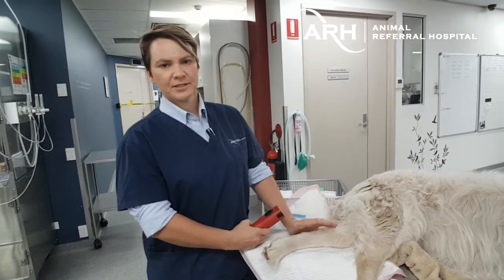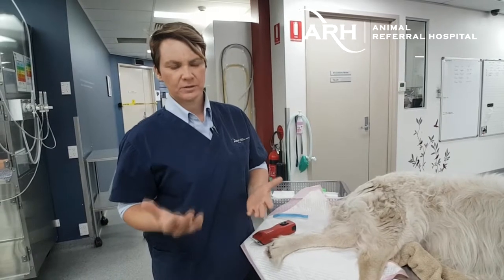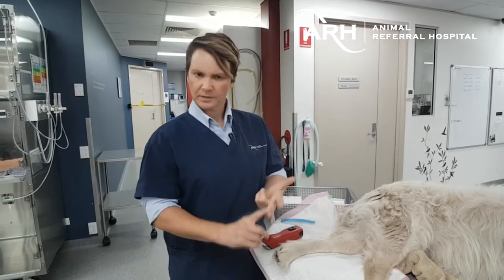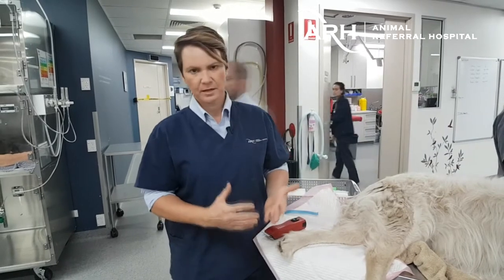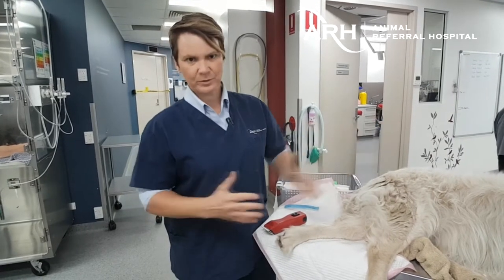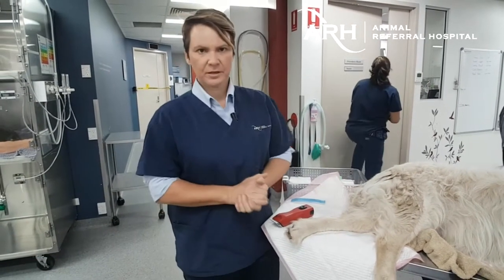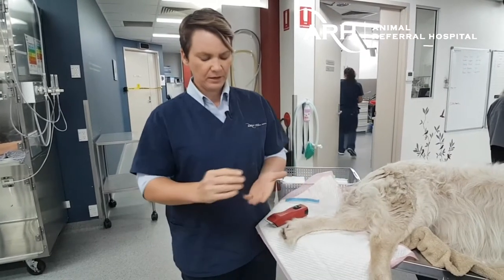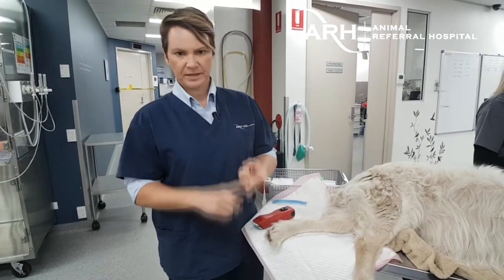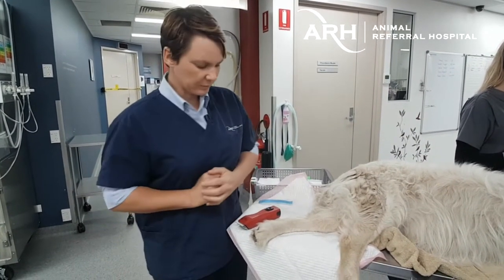Placement of the arterial catheter is probably the most technically challenging part of establishing invasive blood pressure monitoring. This is a technique that needs to be practiced over and over again by surgery nurses, ICU nurses, criticalists, and anaesthetists — whoever is going to be doing these catheters regularly. Best place to practice is to make friends with your surgery department and get a big healthy TPLO or TTA. The catheter being placed can also be used for arterial blood gas sampling, or attached to an invasive pressure line.